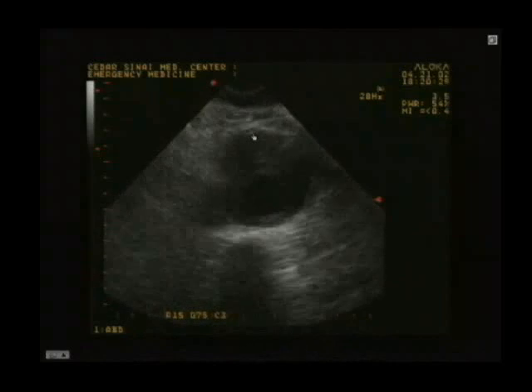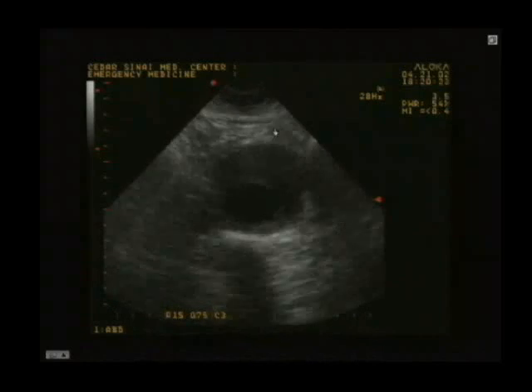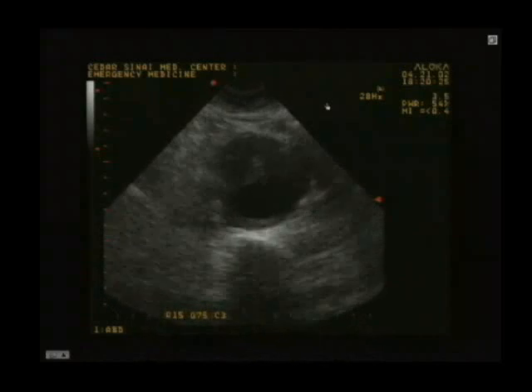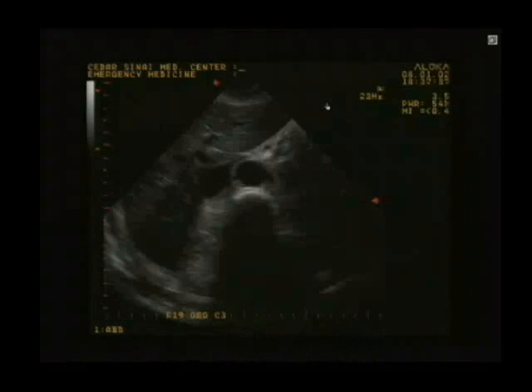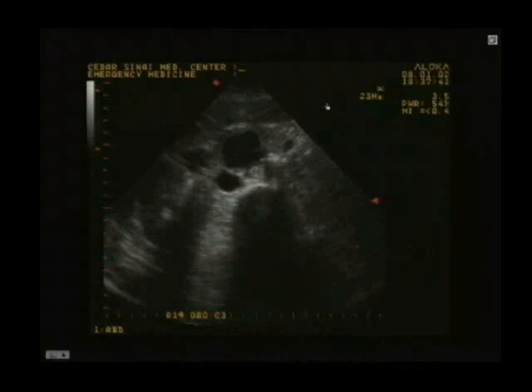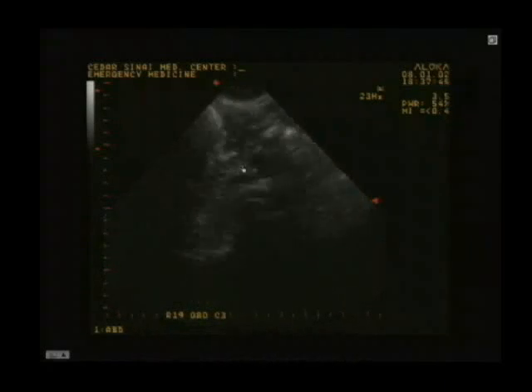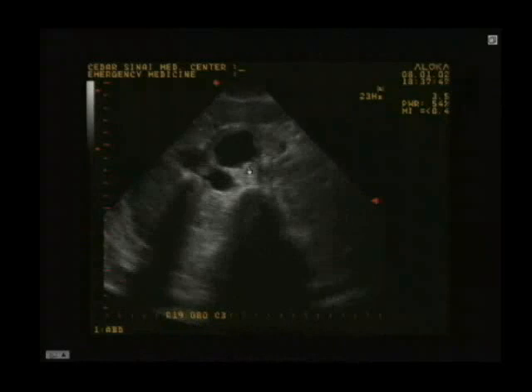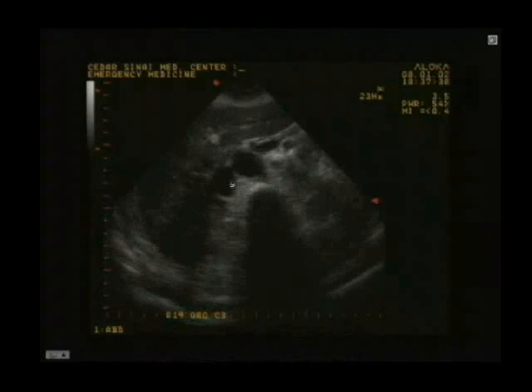What would calcium look like? The very edges that are hyperechoic, that's calcium. Just like we saw with the gallstone. Take a look at this patient, transverse view again. So start off looking normal, but look at this aorta from here to here, pretty wide, here to here, and normal right there. This is IVC, this is vertebral shadow right here.